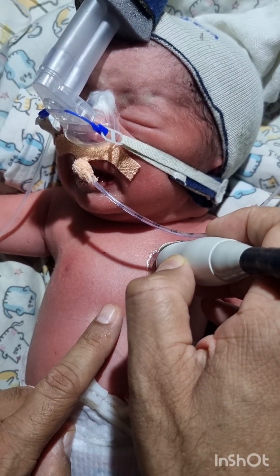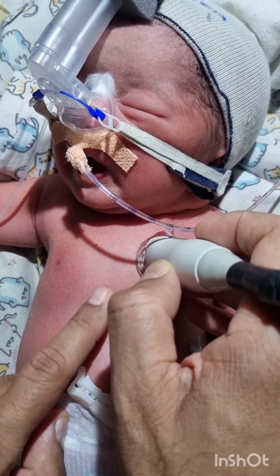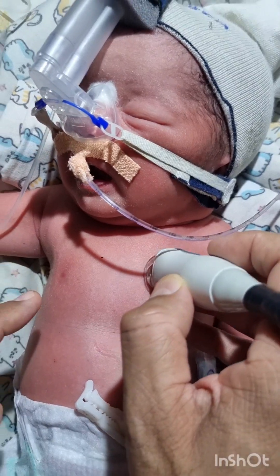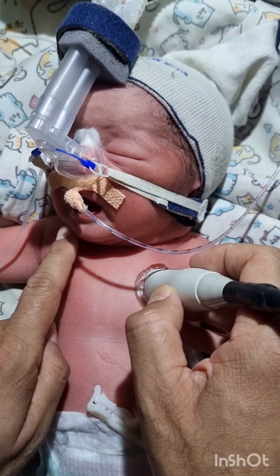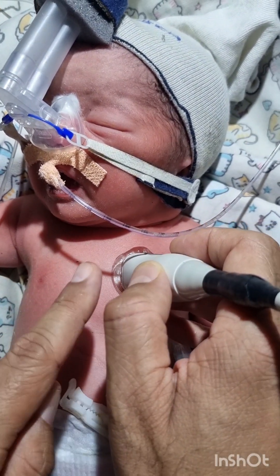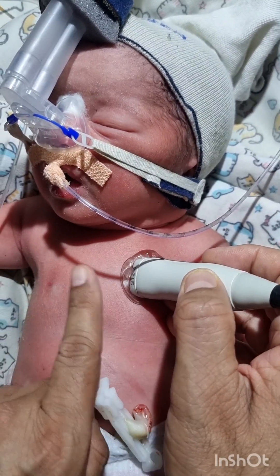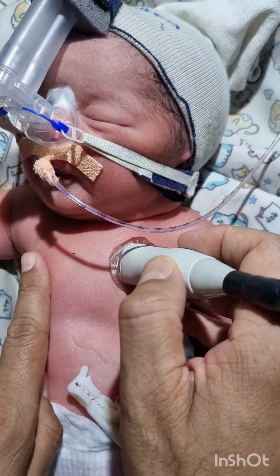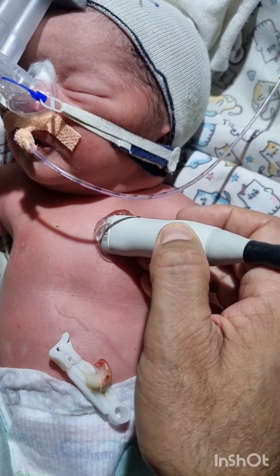So if we keep the probe here on the left side of the sternum with the pointer pointing at 12 o'clock, if you want to see the SVC which is on the right side of the baby, you have to sweep the probe towards the right of the baby.